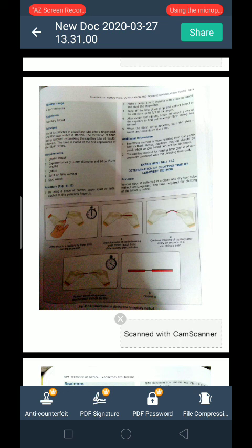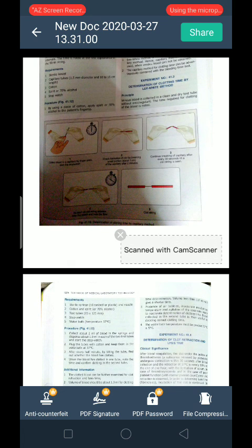note the time. If the time is within the limit for this test, which is 5 to 12 minutes, then you can say the patient has a normal blood clotting time. If it is beyond the normal limit, then you can say your platelet clotting factors are not properly functioning. And we use this test for the measurement of intrinsic clotting factors. Thank you.